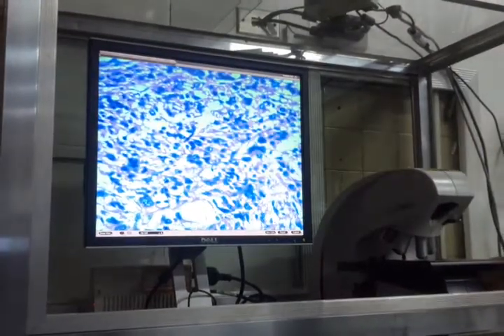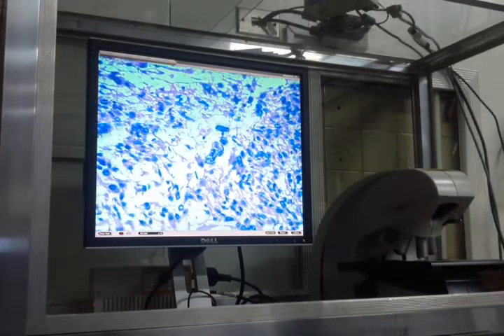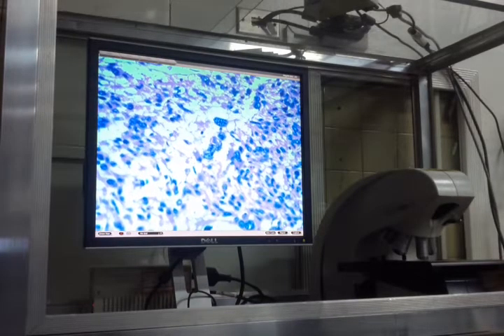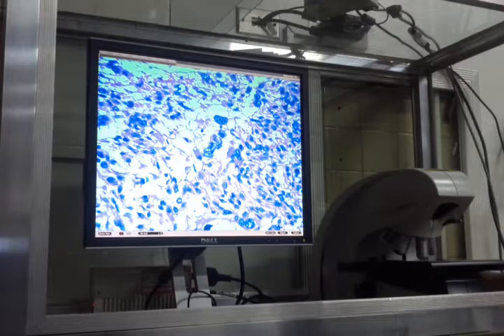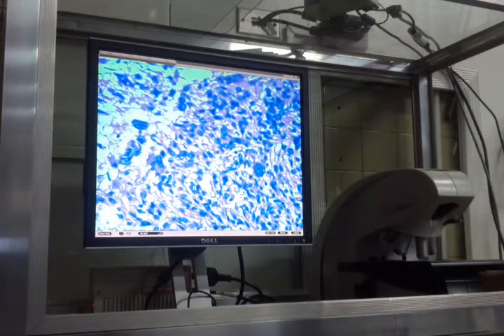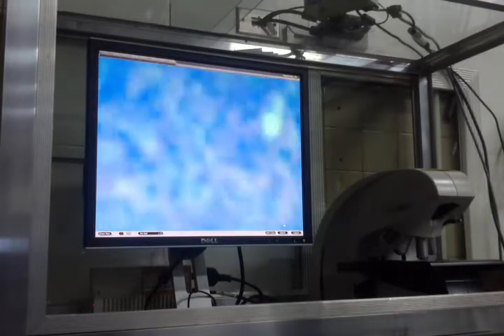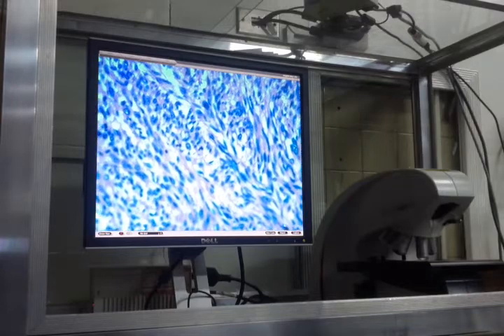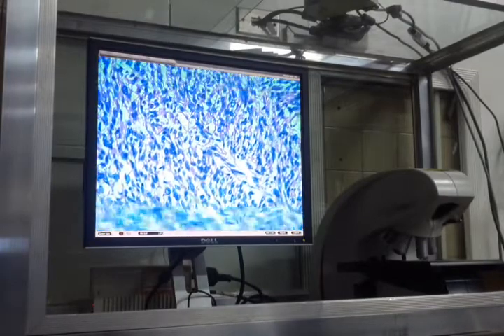Mitosis, increased number of mitosis, more than 10 per 10 high power field or 1 per high power field. You have nuclear atypia and you have giant cell forms. Masyadong malaki ito comparing to this. Kaya ang tawag dito, giant cell form. Not necessarily multinucleated. Okay? Benign or malignant? Malignant, tissue of origin, smooth muscle, nomenclature. Sarcoma.